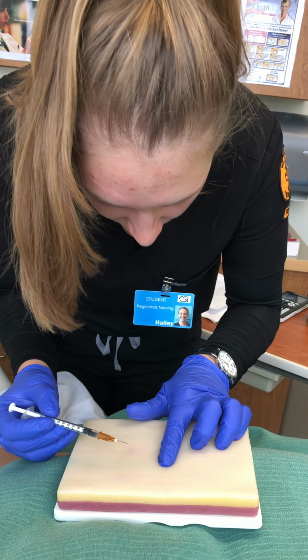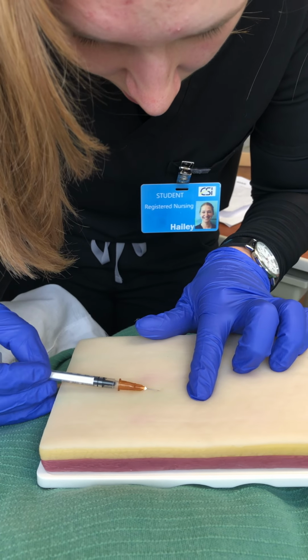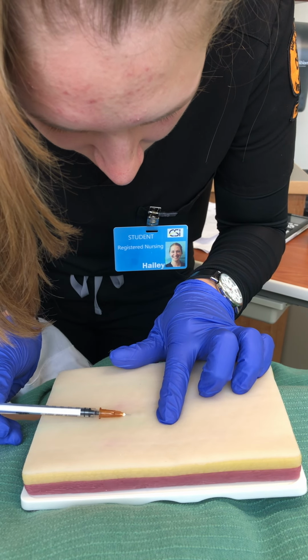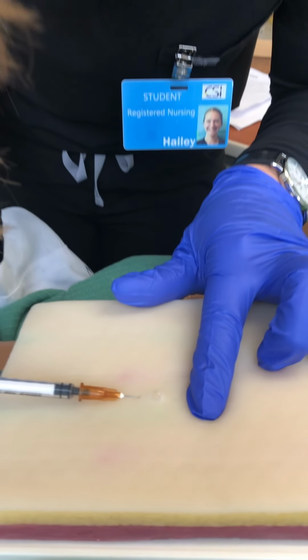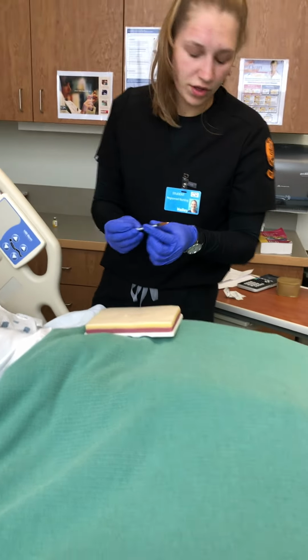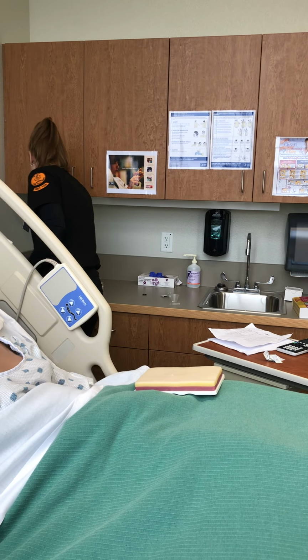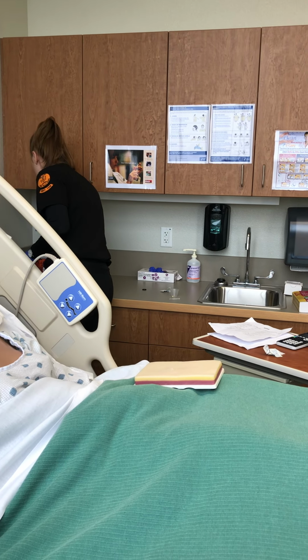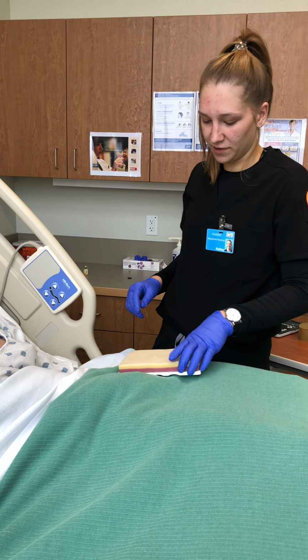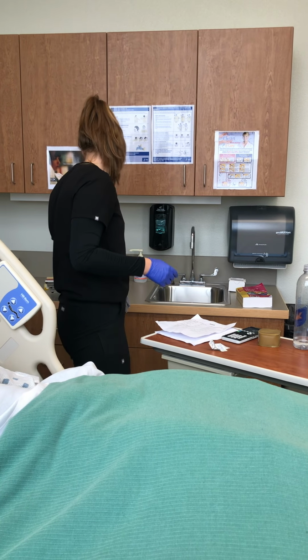And I'm going to pull it taut just a little bit, and I'm going to go bevel up. I'm going to go right underneath the skin. I'm going to push it in and pull it back out at the same angle, and then I'm going to mark that with a circle or something of that sort. I'm going to go ahead and dispose of this in the sharps container. Okay, how are you feeling, Miss Betty? You still feeling good? Yes, okay. I'm going to go ahead and move this off to the side now.